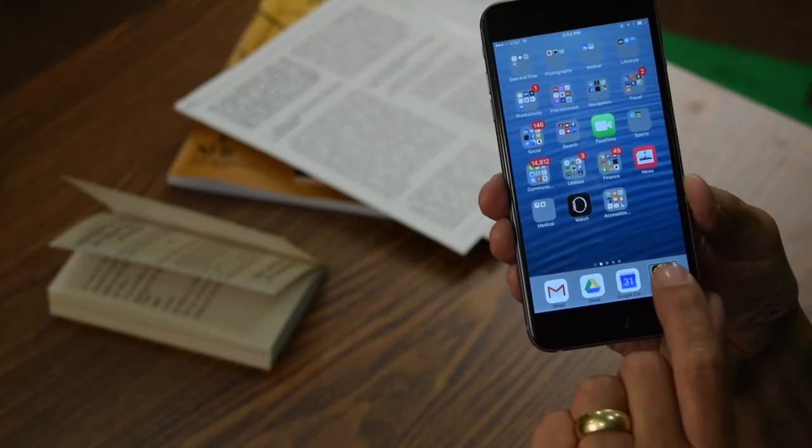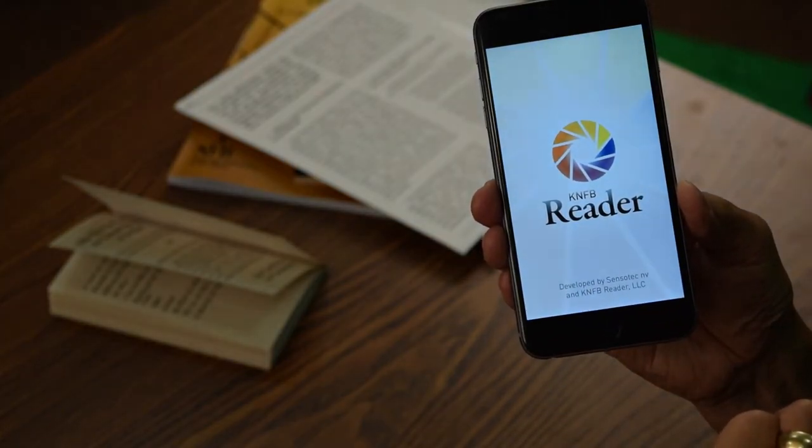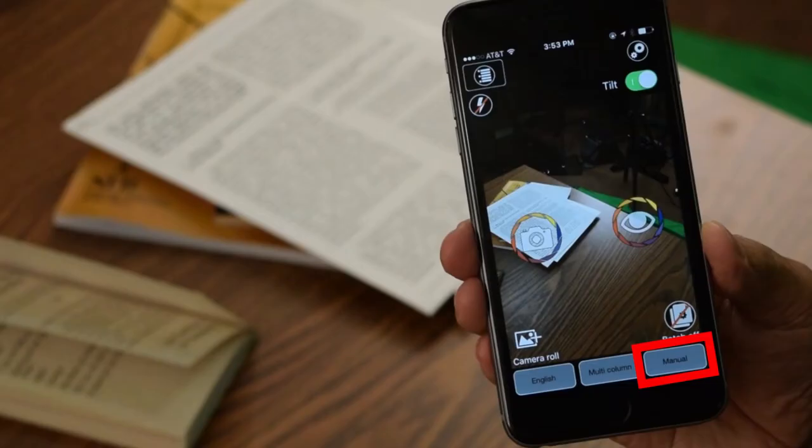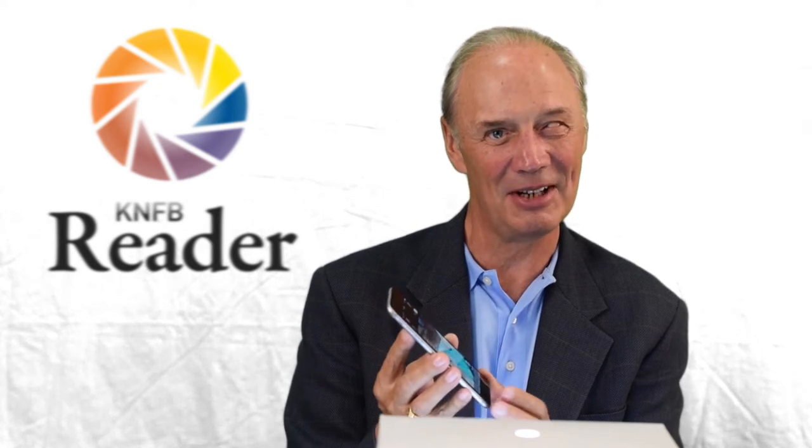Let's start the reader. We're back at the Take Picture screen. To use a stand, we have to change the profile. Profile is located on the bottom row of icons, so I'm going to touch near the home button on the bottom row. I'll swipe to the left to reach Select Profile, and double tap.